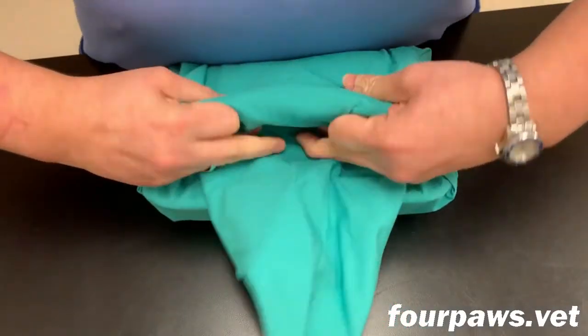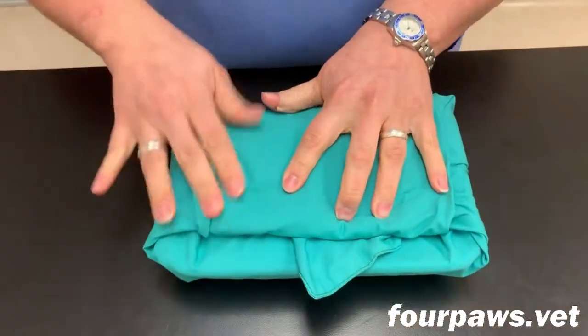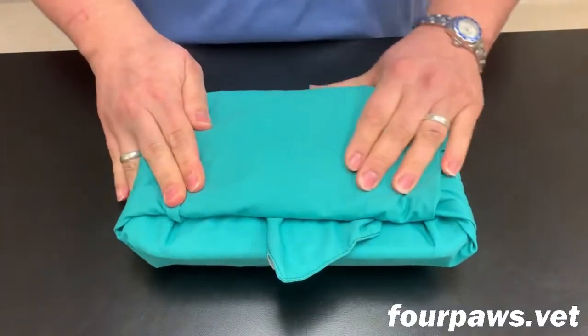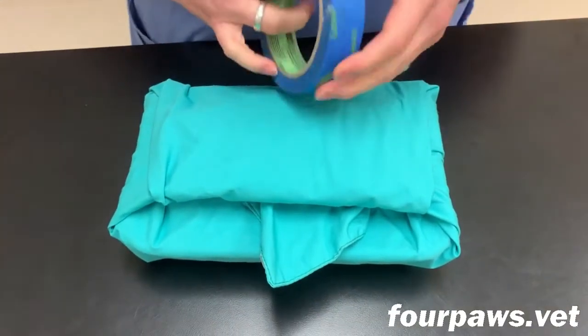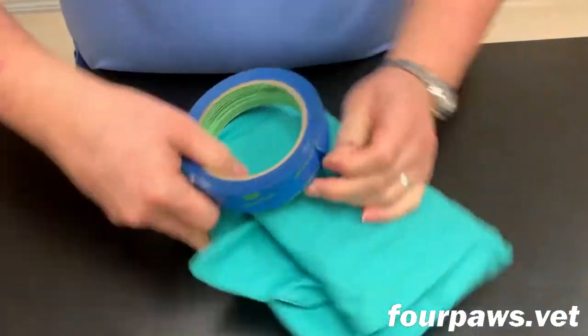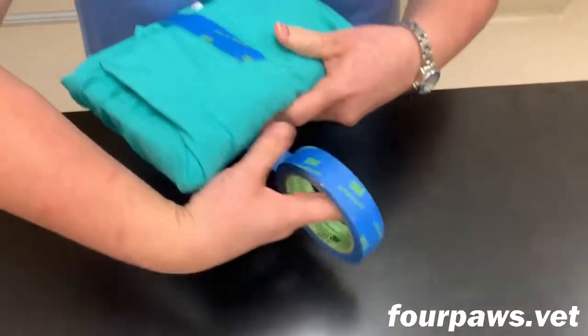This allows a non-sterile assistant to pull on the tab to start the unwrapping process of the pack in surgery. By doing it this way, they do not touch the inside surfaces of the pack, which remain sterile, and therefore the surgeon can still touch the inside surfaces.